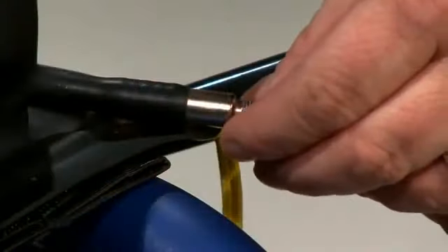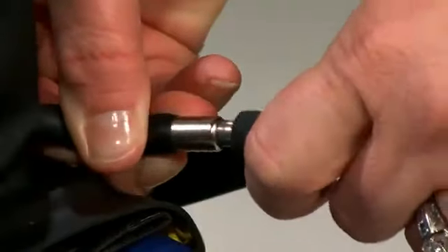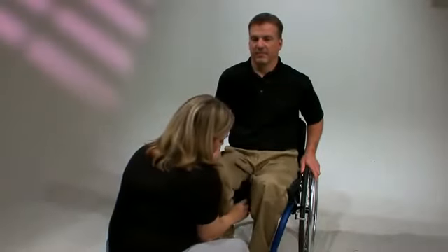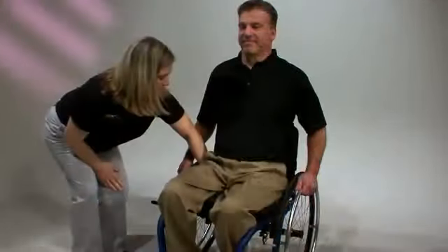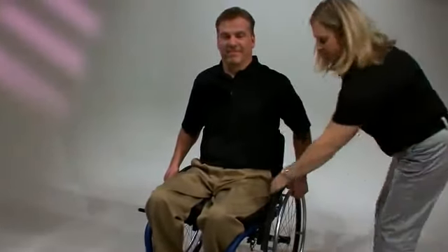Now let's show you how to use the isoflow control to correct a posterior pelvic tilt. Start with the steps for proper inflation, but for this type of correction keep more air — approximately 1 inch or 2.5 centimeters — under the pelvis. Have the caregiver lift both of the individual's knees to put more pressure on the pelvis. This forces air to the front of the cushion, creating a well for the pelvis and helping to block the pelvis from sliding forward. Recheck each compartment of the cushion to ensure proper inflation.